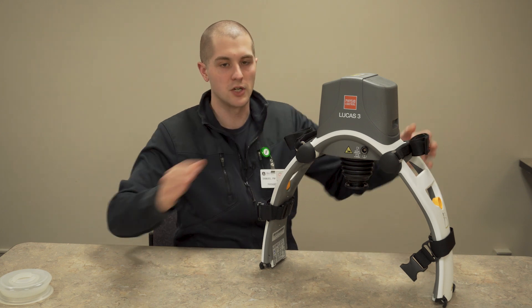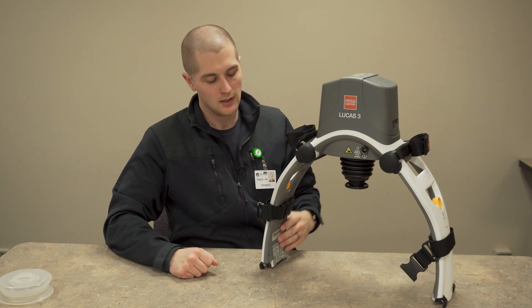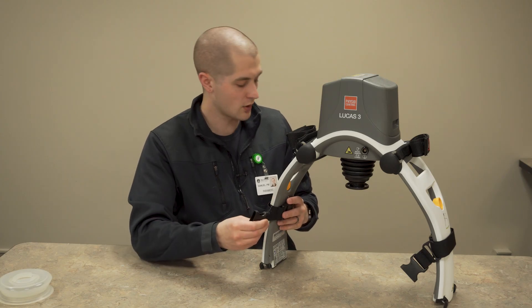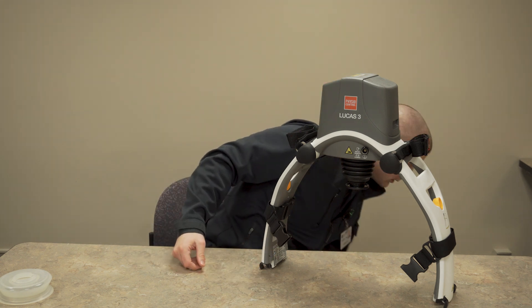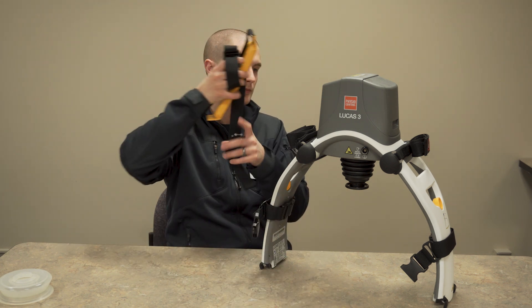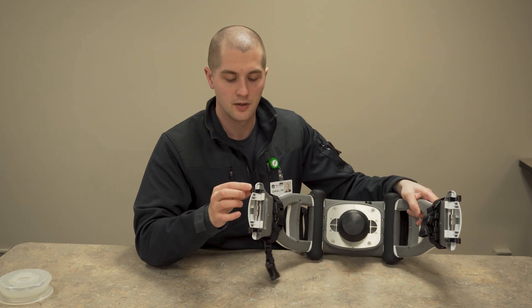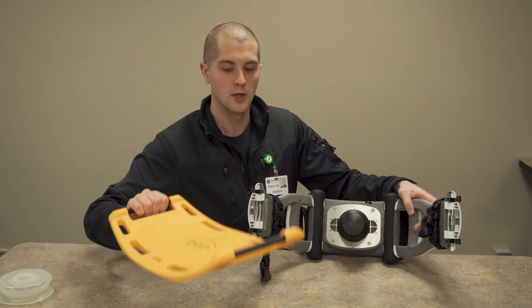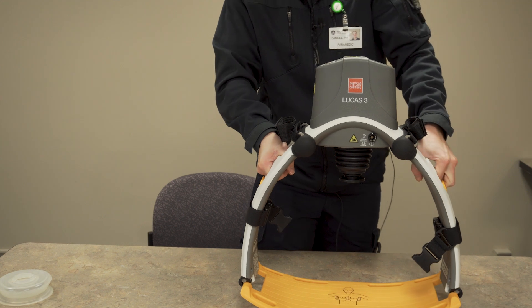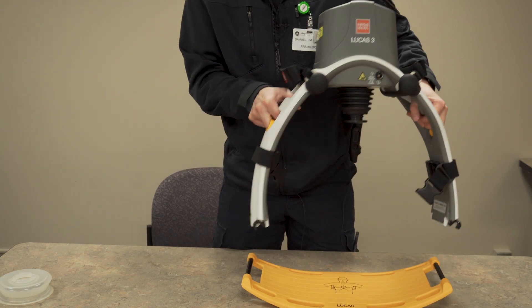On either side, you have arm holds — the patient's arms can be brought up into the Lucas 3 to keep them neat and in an easy location. On the sides, you have two release pins that are going to release it from the base plate. You also have two straps that connect to the head strap, which will go under the patient's head. Underneath, you have some clips that will clip right into your backboard. To release that, you just pull these yellow rings and pull it right off.